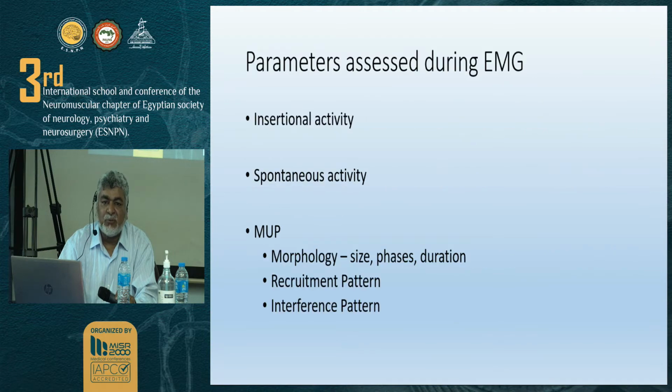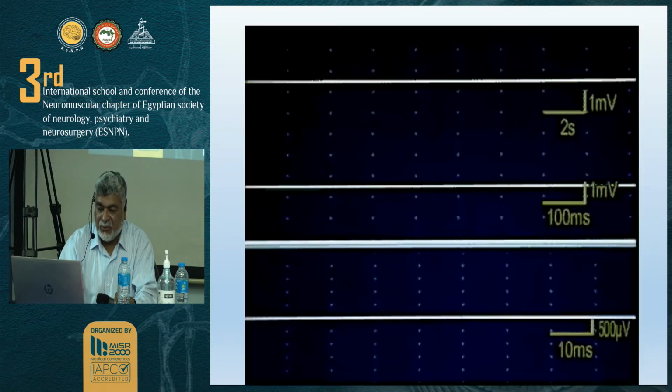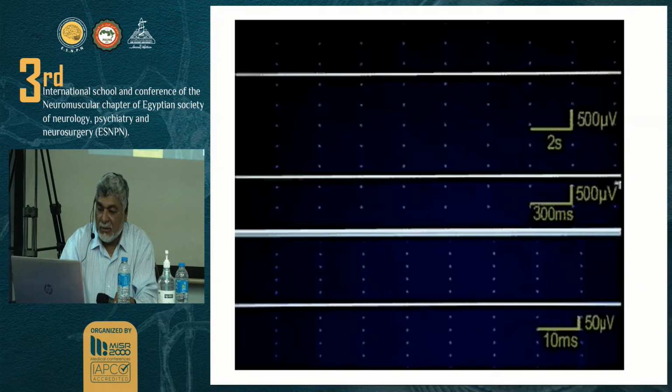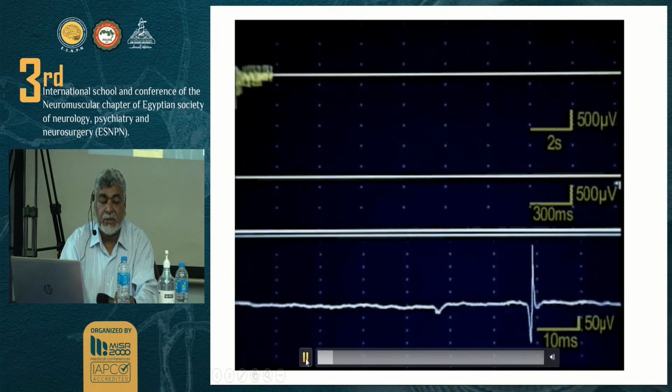The reason I want more sound is, first, to keep you awake, but also because I want to tell you how the sound matters. Otherwise, just looking at the screen is no use. EMG is not just watching, but hearing the sound. Any better? Sorry, guys, I'm a little particular, but that's what it's all about. Much better. Can you hear it now?